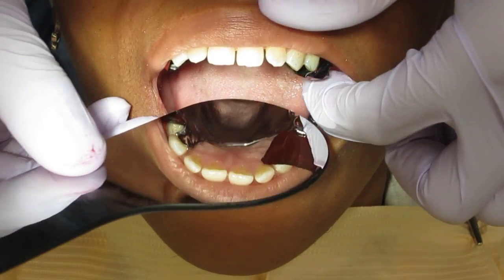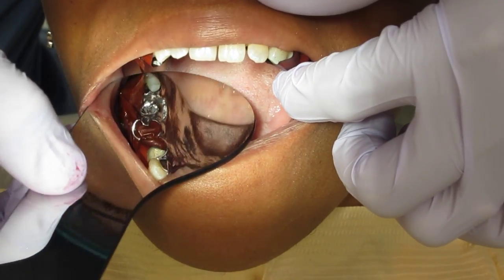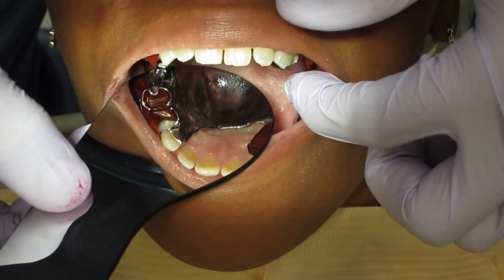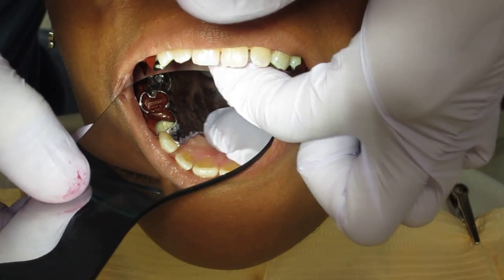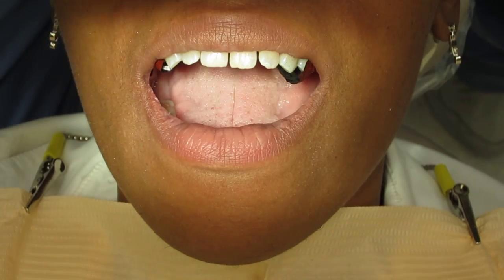So we're looking for rest seats. Here it is with the articulating paper. Looking for rest seats, making sure they're all the way down. And also making sure there's no gap there.